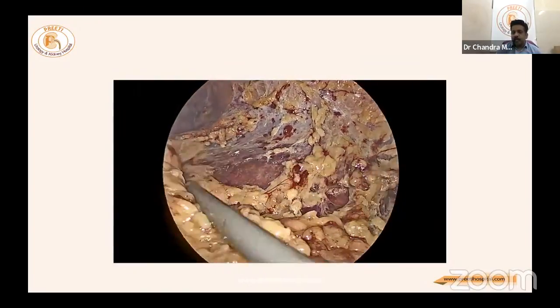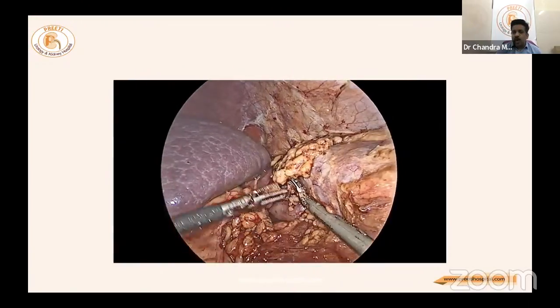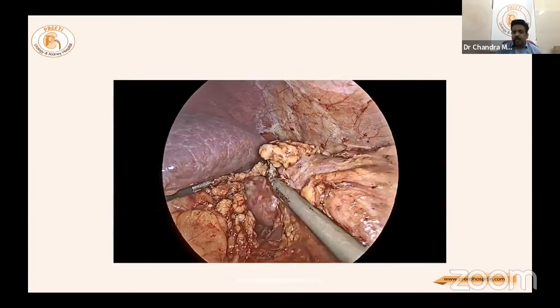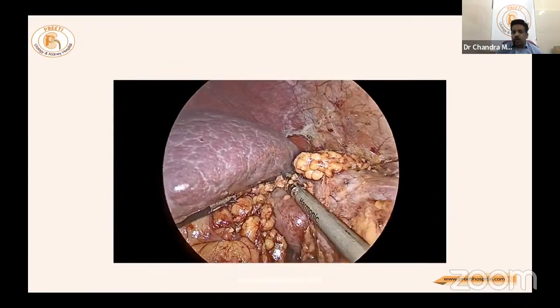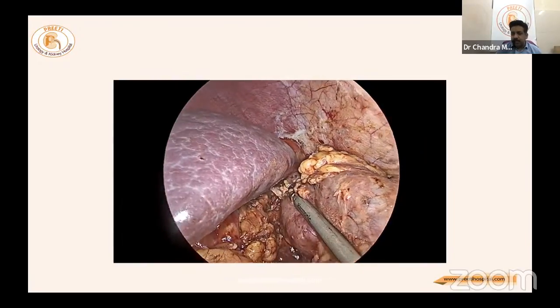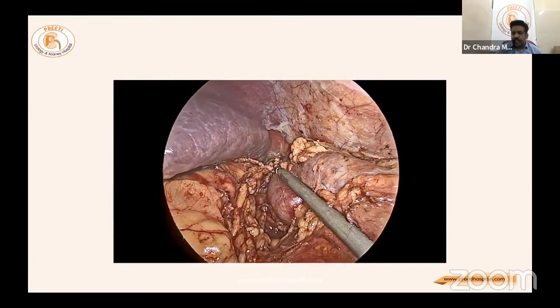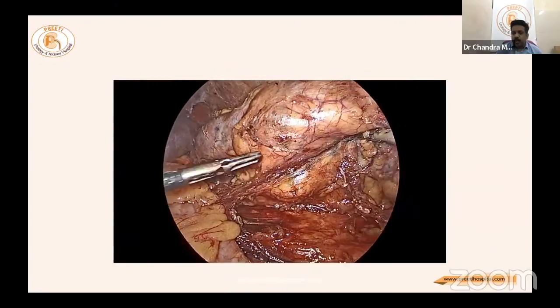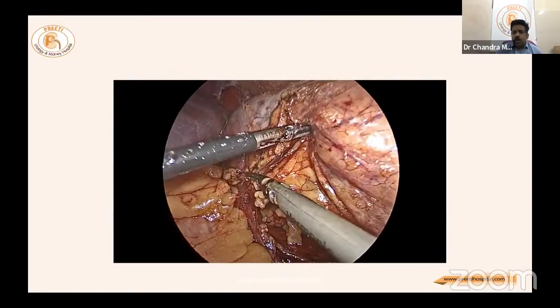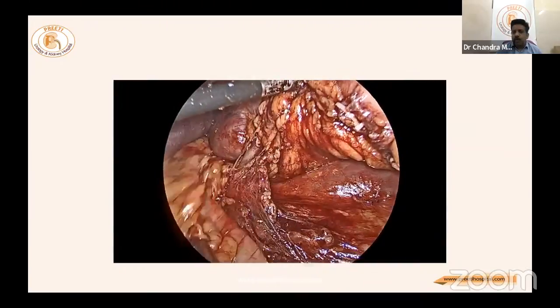For any tumor approaching the hilum, completely flip the kidney. See all around the mobilized kidney — upper pole attachment can be difficult to retract for a single person. The secret is to stay close to the kidney, maintain traction, and remain in one plane only, especially in obese patients. In hemi nephrectomy of the lower pole, there is no point in disturbing the adrenal. Remove all visible fat.